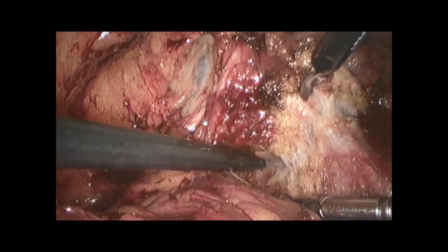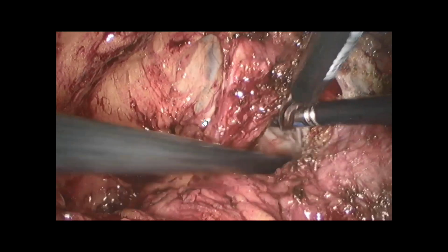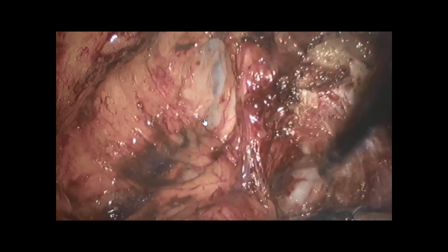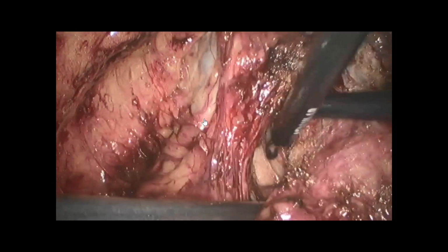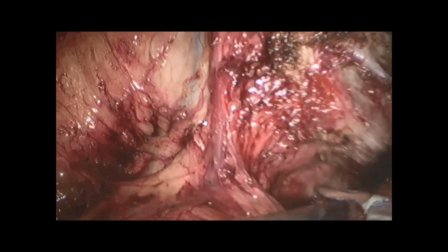And you see, immediately you can see posteriorly the aspect of the seminal vesicle. You have the posterior layer, and you will finish at the level of the bladder neck. So I like to do it like this in 90% of the cases.